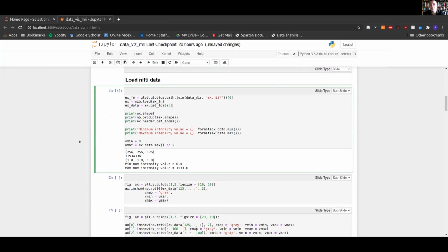When we take all of these individual voxels and lay them out end to end, there's actually 11,534,336. So it's not really big data because it fits in RAM, but big data because it's a lot to mentally keep track of.